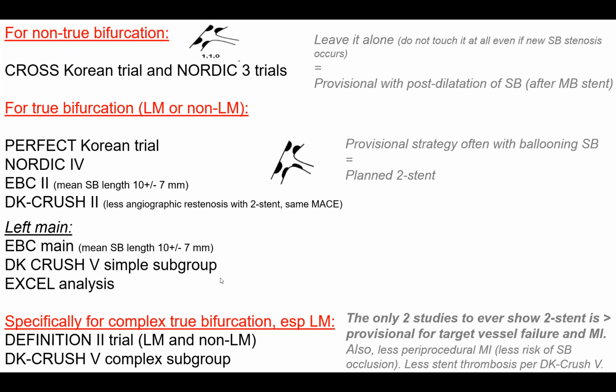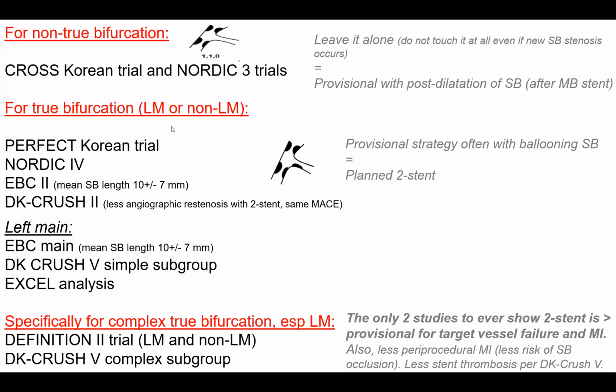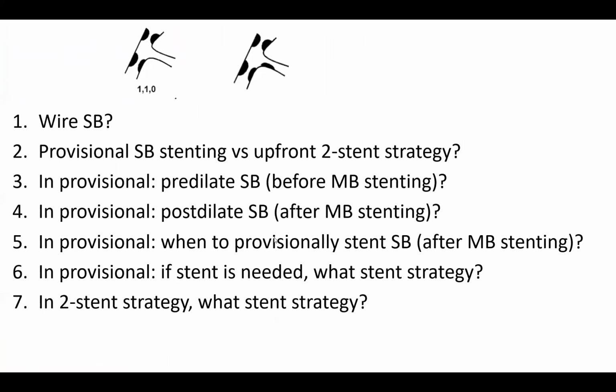Okay, so everybody understood those trials, I hope, and how they dictated different treatment for each different bifurcation. I will now, with those in mind, the different classification, the different types of bifurcation, and the different trials applicable for each bifurcation, try to put together, based on that data and on my review of each one of those protocols, an algorithm of how to perform bifurcation stenting, the stepwise approach.